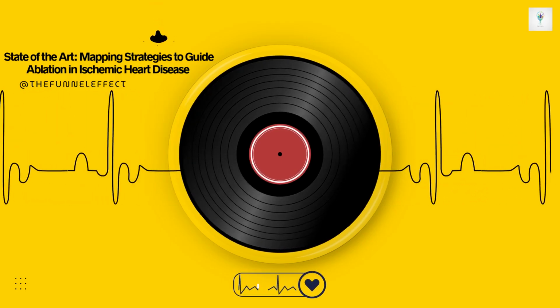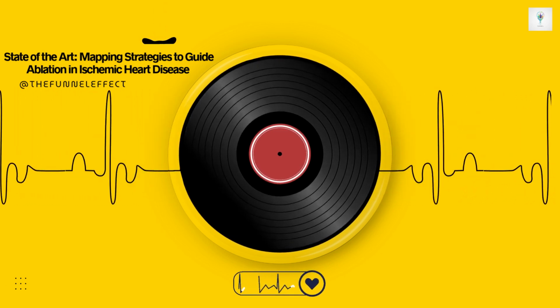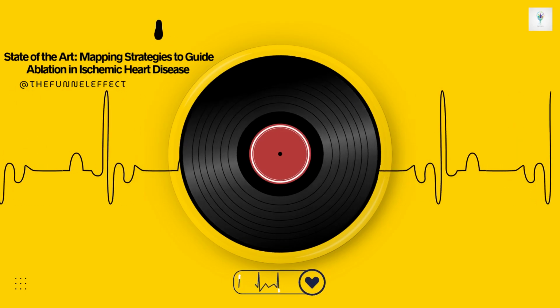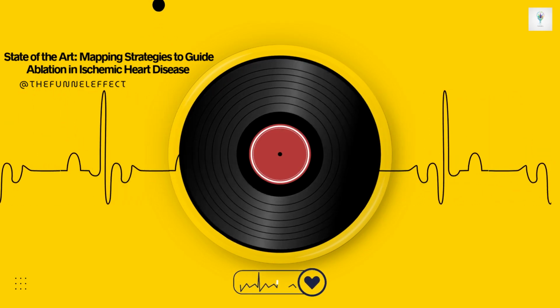The ultimate goal, really, is to move beyond just painting a voltage map and towards being able to functionally interrogate and understand every potential conducting pathway within that scar, whether the VT is active at that moment or not. That ambition to map every pathway brings us right back to that fundamental challenge we started with, and it sets up our final provocative thought for you, the listener.